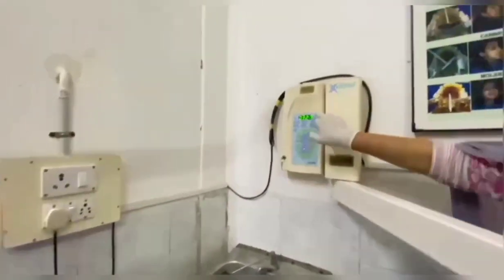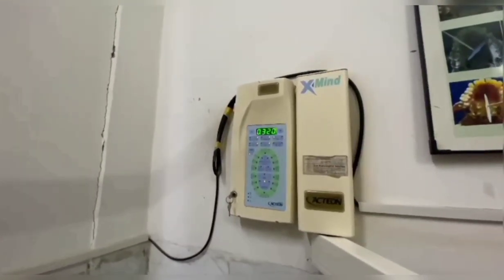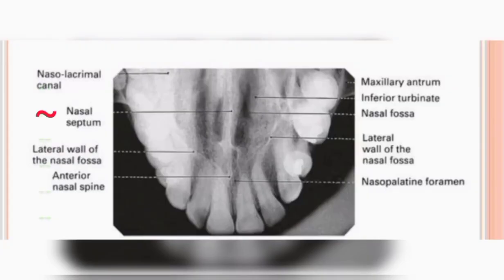Exposure time is 0.32 seconds. This projection shows the nasal septum, lateral wall of nasal fossa, anterior nasal spine, nasopalatine foramen, nasal fossa, and the teeth from canine to canine.